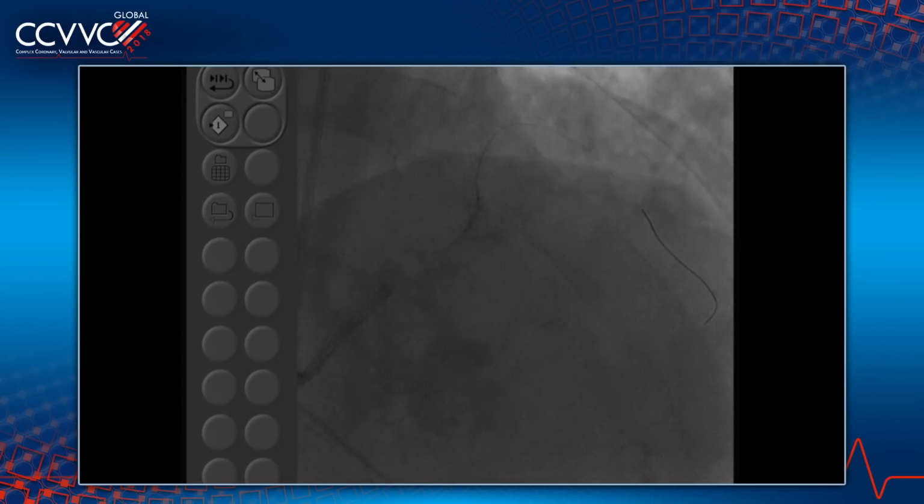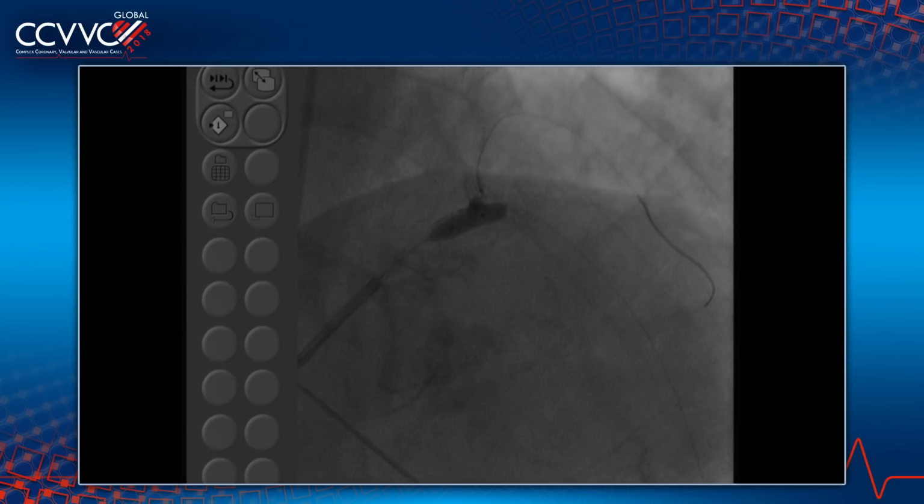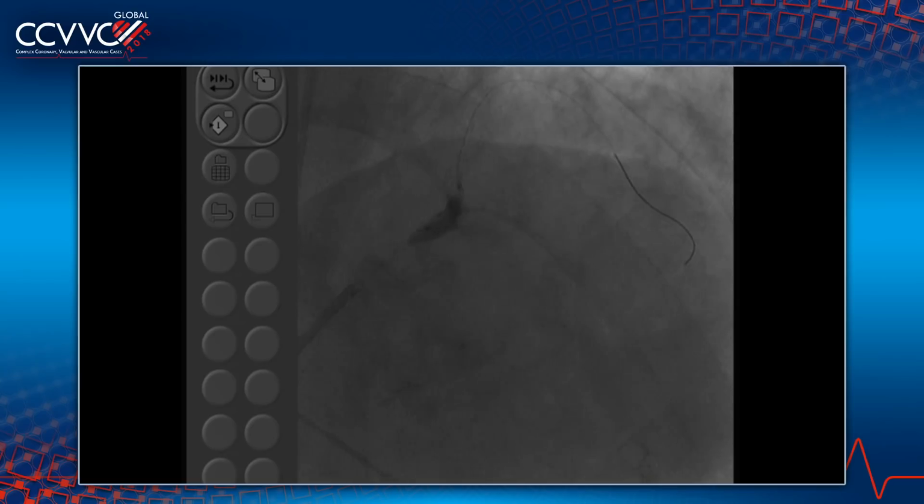No, I do think, though, in the larger vessels, we often underestimate. Yeah, if there is a question. And then the question is, what do you use, doctor? Both. Everyone here uses IVUS imaging. Anyone uses OCT for the final? You use OCT, Paul, would you even image here? Nothing wrong in using it. I use the IVUS map, pretty much like OCT.